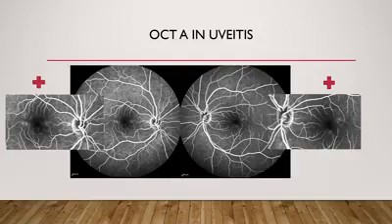So at this point, I decided to do the OCTA. And this is the finding of the OCTA.